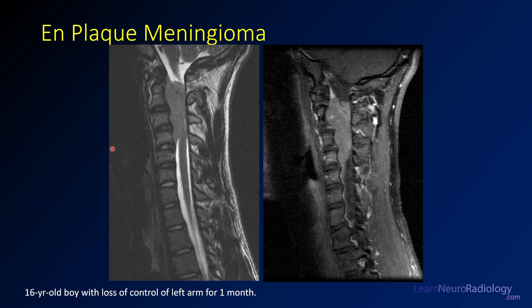This is an example of an en plaque meningioma. Rather than being rounded and focal, it extends along a longer length of the spinal canal. On T2 you see the mass extending from about C2 to C4 — T2 intermediate to dark — and you can catch a little bit of the dura traversing through it, so it's partially intradural and partially extradural. On post-contrast images, you see avid enhancement, some scalloping of the bone, and dural tails extending along the lesion. This was a 16-year-old boy having trouble controlling his right arm for about a month.